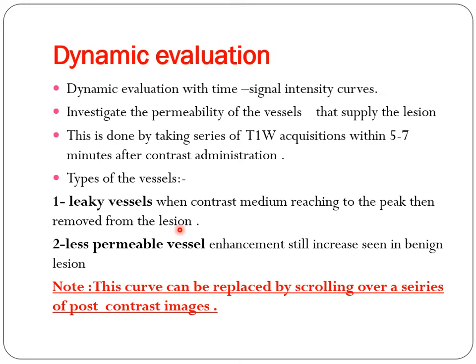It means you don't wait 5 to 7 minutes and then do the acquisition. No, you give the contrast and start, and within 5 to 7 minutes you finish the dynamic. It's automatic. But when to start? After 5 to 7 minutes? No. You start and finish within 5 to 7 minutes. Be careful of that point. Don't understand it wrong.